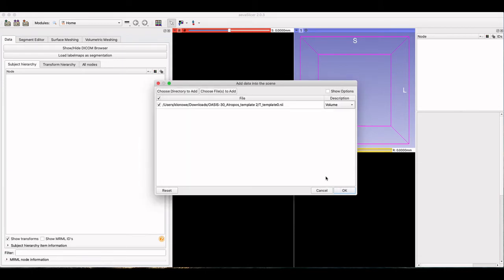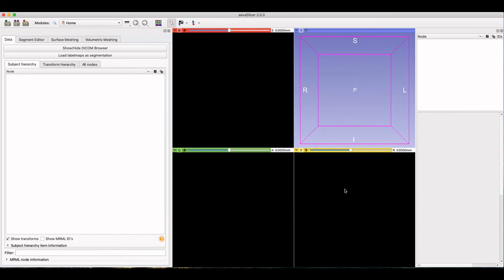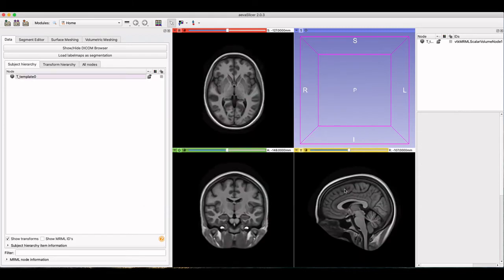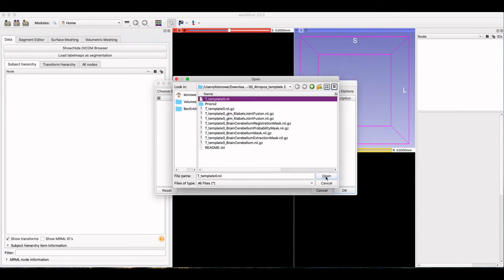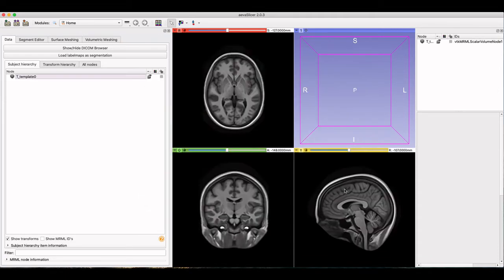First, I'll load the brain imaging data. We can add the set of saved labels from the Mindboggle data. It contains six labeled regions of the brain. They can either be added as label maps or directly as segmentations to be edited.